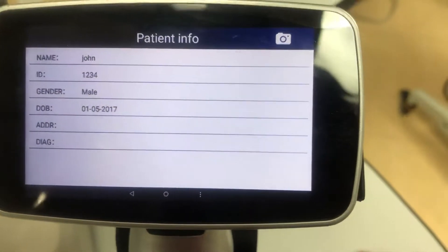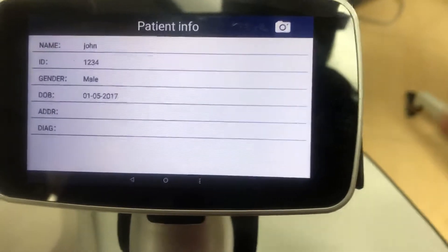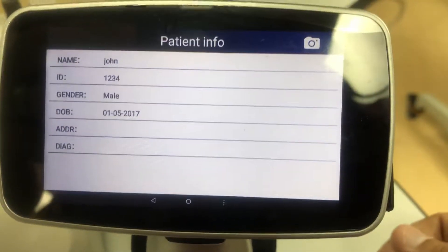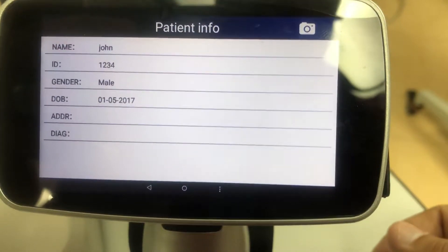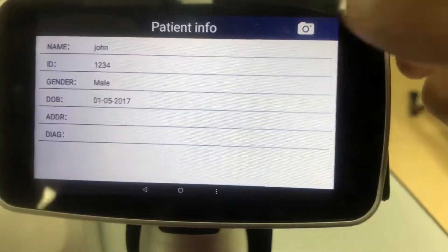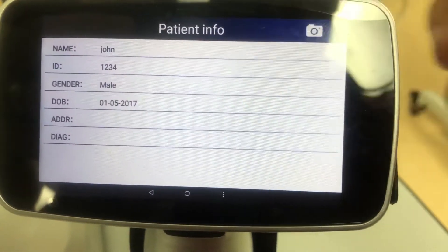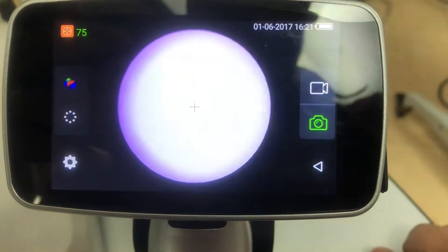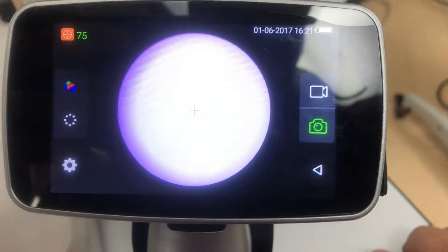Once you're on their folder, you'll want to record an image to save on that patient's personal information. Just click on that little camera on top and you can use the camera.